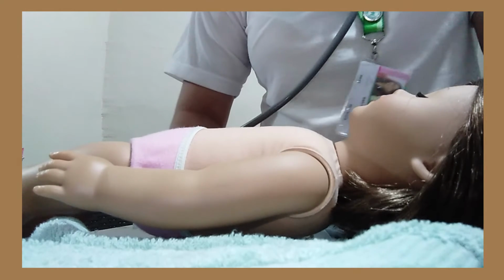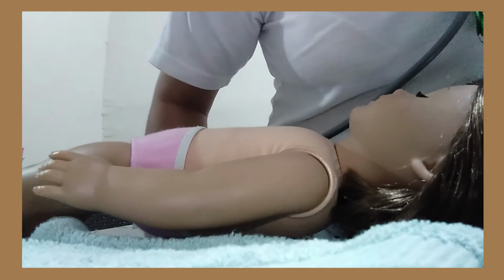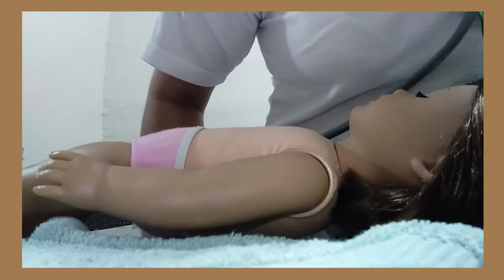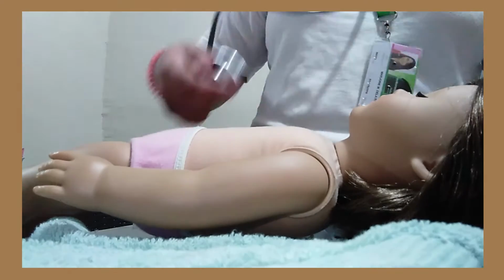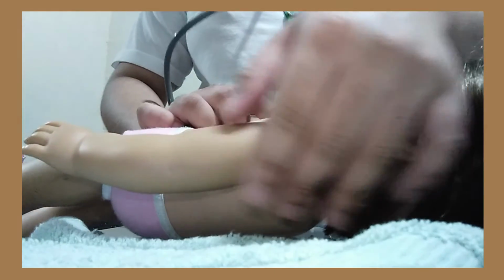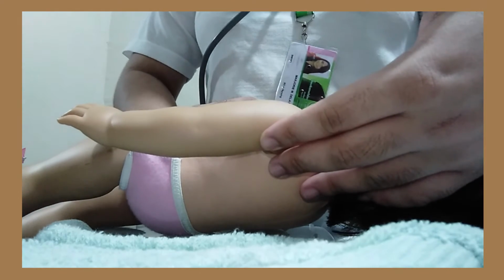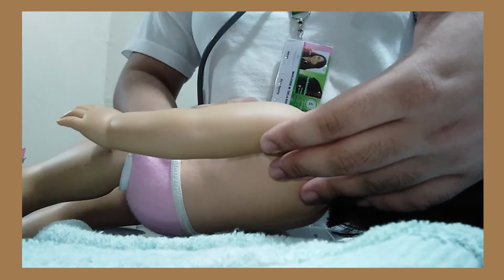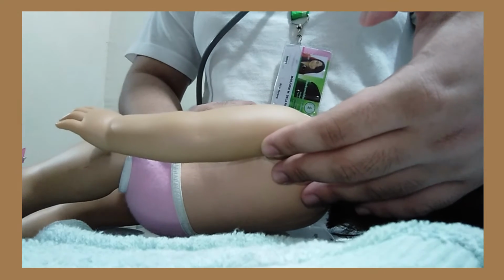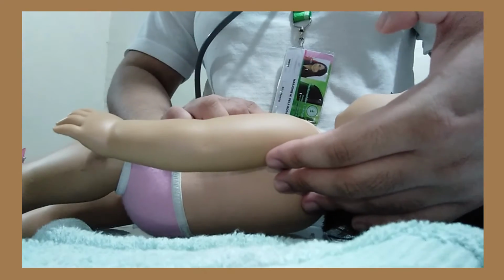So what we're going to be doing is to place the bell on the mitral area, then move the patient into the left lateral decubitus position for full expiration. Okay, ma'am. Deep breath in. Deep breath out all the way. Okay, then hold it, ma'am. It is in the bell. There.